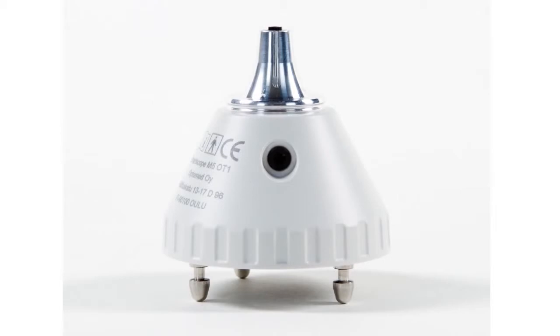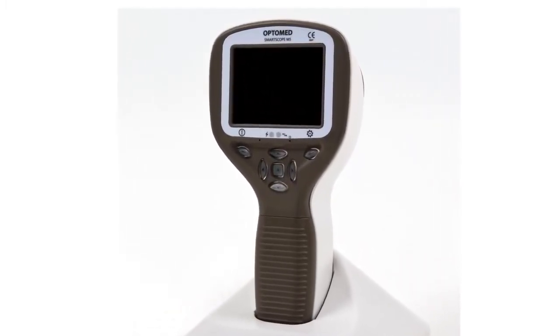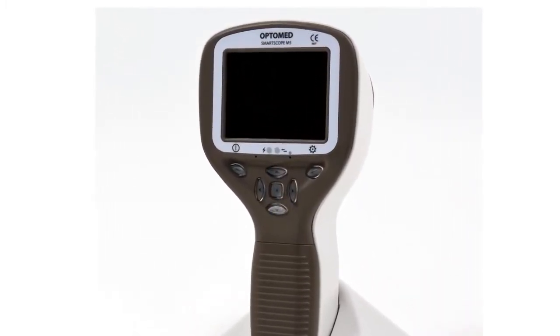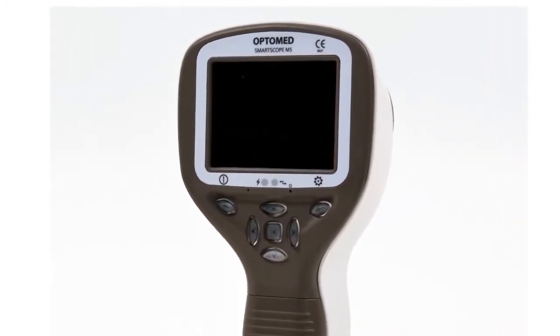Optomed Smartscope M5 OT1 is a digital otoscopic camera that enables examining the inner ear canal and tympanic membrane and documenting patient data through digital images and video. First, let's go through the basic use and settings of the device.